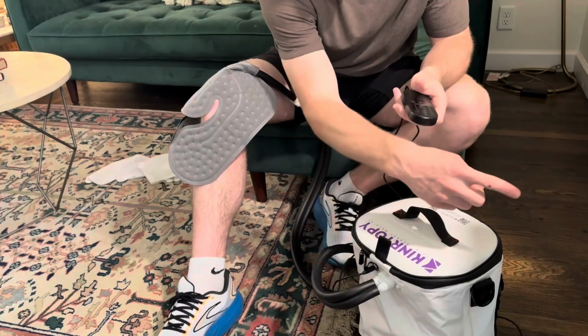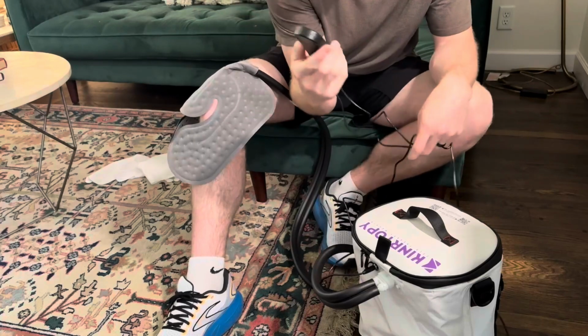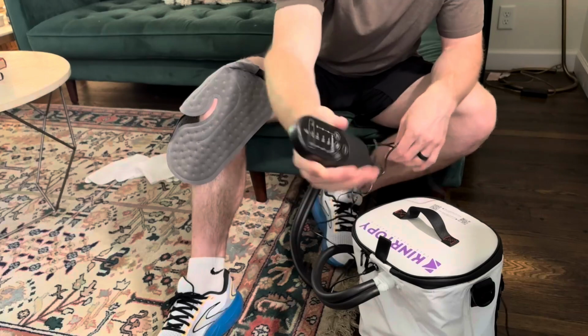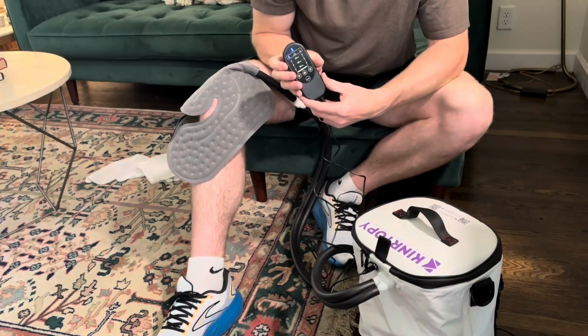So you can either connect it directly into the wall and it's just on at all times, or you can connect it, which I think is the preferred method, through this remote. And so you've got an on button here. So I'm just gonna go ahead and click this power button. So now it's on.